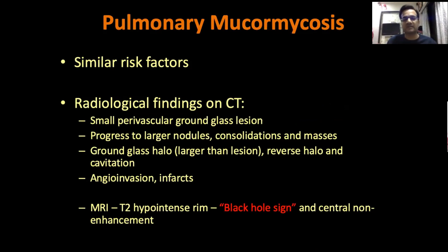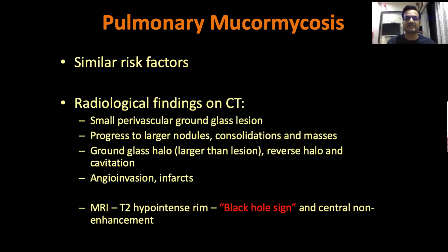In just the next couple of days or 3-day follow-up, you will see the lesion growing out of proportion. It progresses to large nodules, consolidation, and masses. The ground glass halo is very common and typical in these cases — sometimes the halo can be larger than the nodule or the lesion itself. Then the reverse halo — remember the reverse halo is a very important sign here.